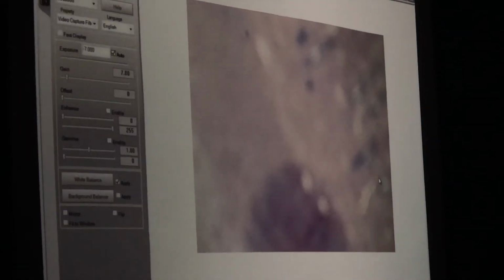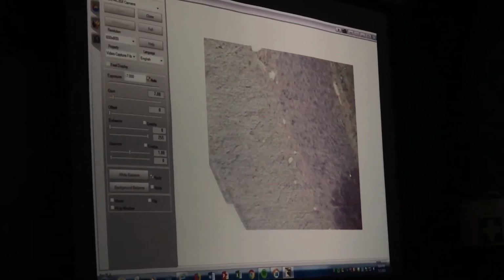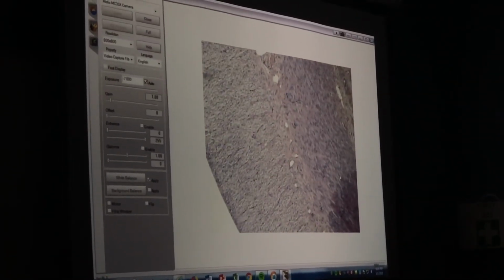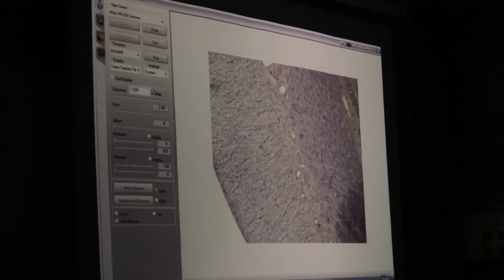All right, how many muscle layers? 3, just like what other organ we know of? Stomach. The stomach, yep. So if you look here, we got 1, 2, 3 layers. And then out here's the perimetrium.